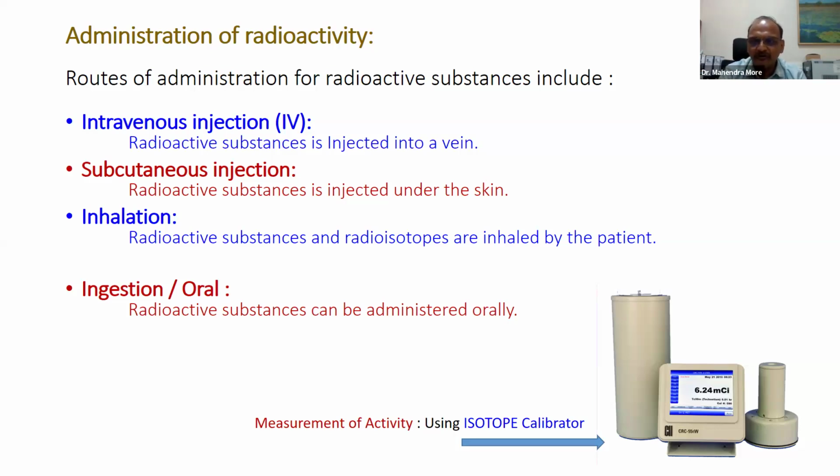So once you put the isotope in that particular well, you will find the amount of activity available for that particular day. Say out of 50 millicurie, what you get in the morning. If you require only 3 millicurie for one particular study, or thyroid function studies are being carried out with 3 to 5 millicurie of technetium-99m, then only that part can be taken out and given to the patient as an IV.